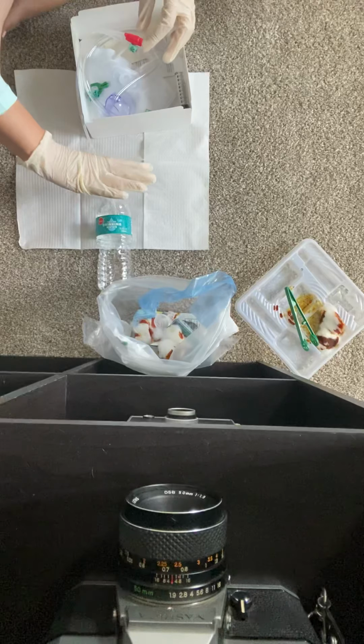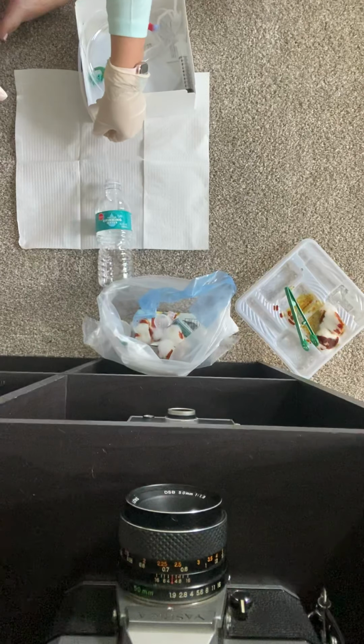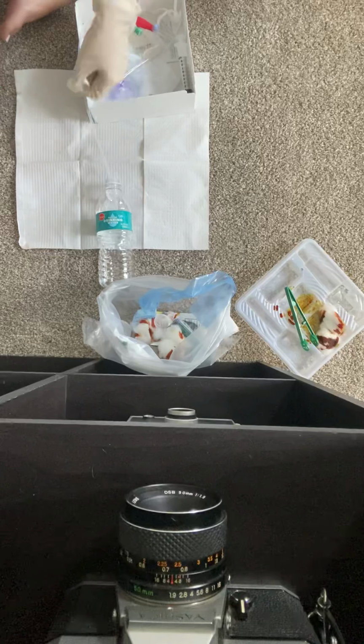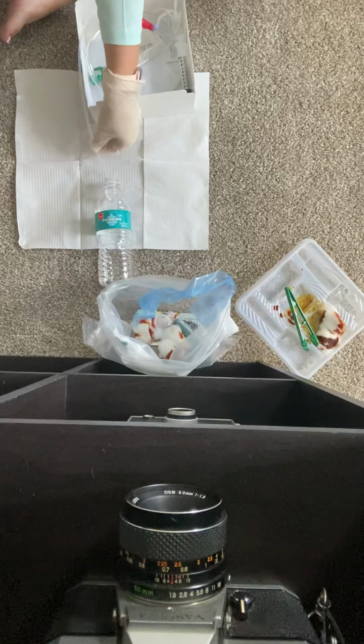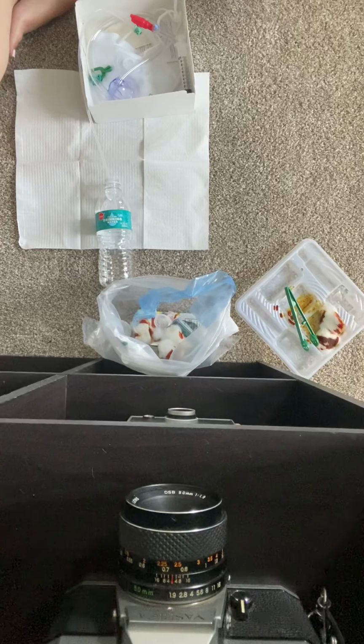Then I'm going to release the labia, and then just pull back on the catheter here so it's stabilized. It's obviously not coming out, and that's as far as it's going to go. So I'm just gently pulling on that. And after that, I am finished with my insertion.